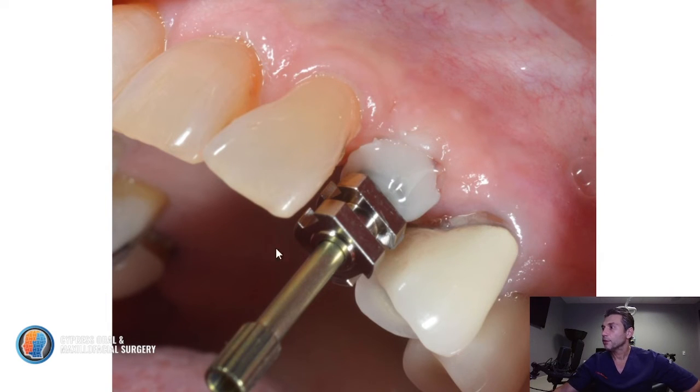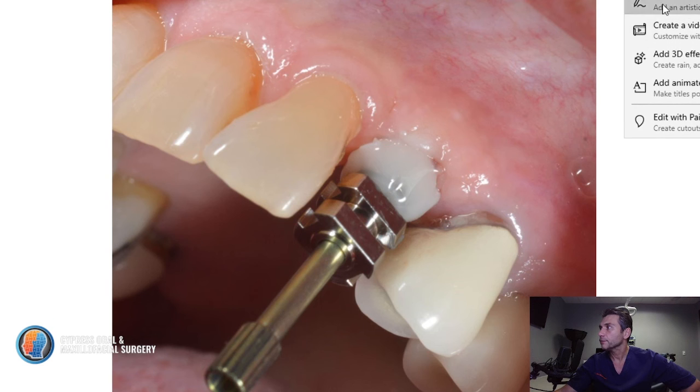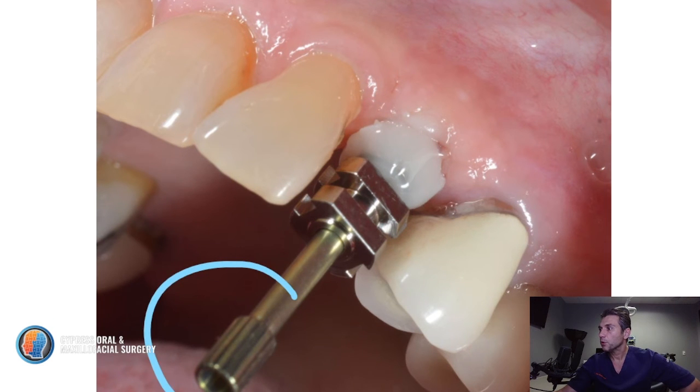You put it in the mouth. This is an open tray. You screw it in, and then you have to make a hole in the impression tray so this part comes off, because once you take the impression of this, this whole thing comes out in the impression.